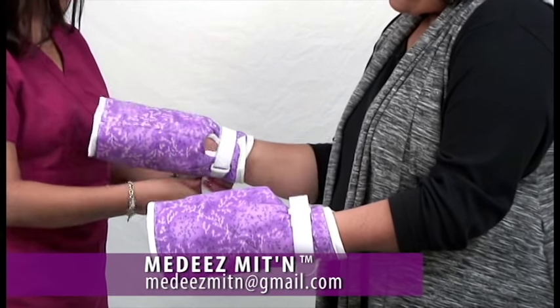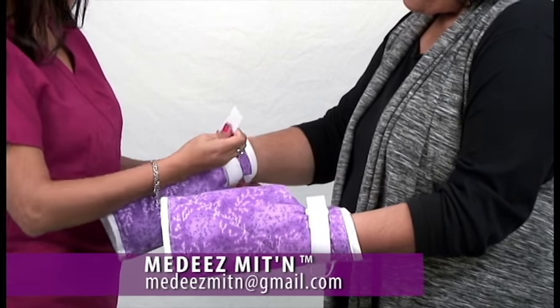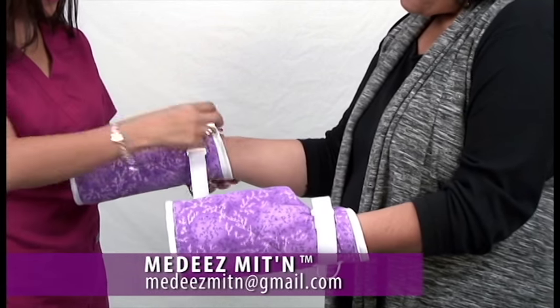Unstrap the mitten, passing the strap back through the loop. Open up the mitten and remove the mitten from the patient.